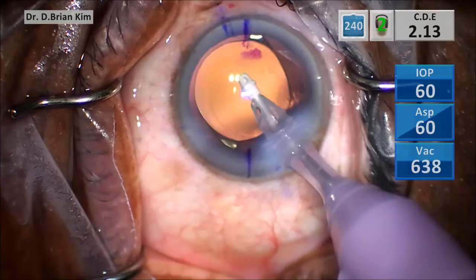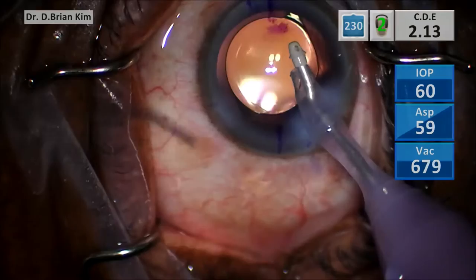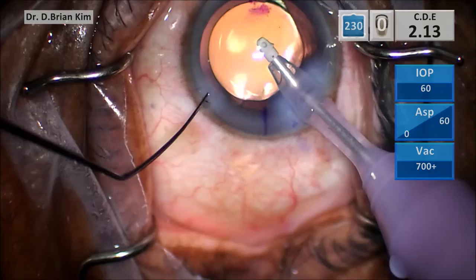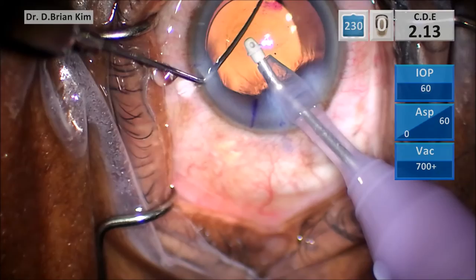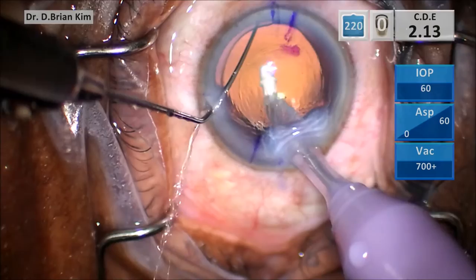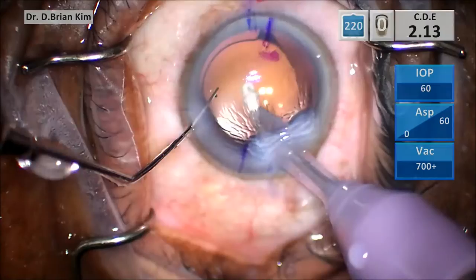We've always been taught not to manipulate the lens in a counterclockwise position, but I will show you that that's not necessarily true. As you can see, once I went behind the lens to remove the viscoelastic, the lens has rotated in a clockwise position. Rather than having to rotate the lens 150 degrees while the I/A handpiece is under active irrigation, I'm able to rotate the lens counterclockwise without any worry that I'm going to tear the capsule.